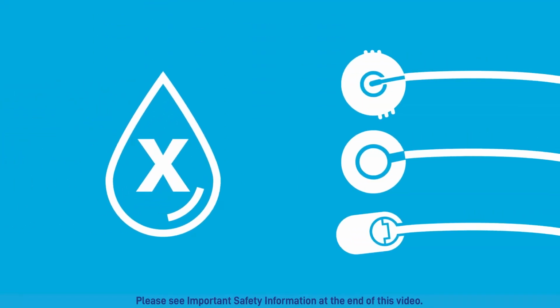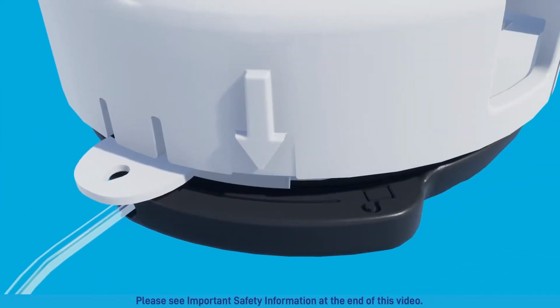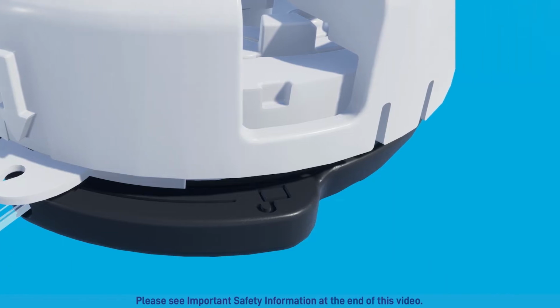If no fluid is visible at the end of the infusion set when priming, there are a couple of possible causes. The filling aid may not be fully rotated. Fully rotate the arrow on the filling aid to the lock symbol on the cassette to begin priming. Another cause may be blocked tubing. Inspect the tubing and straighten any kinked tubing.